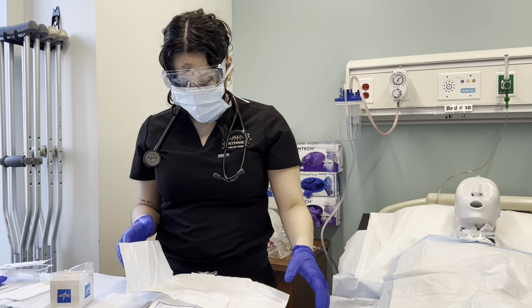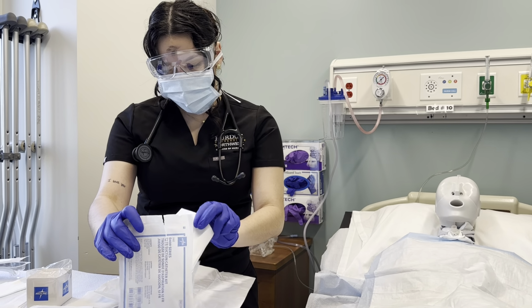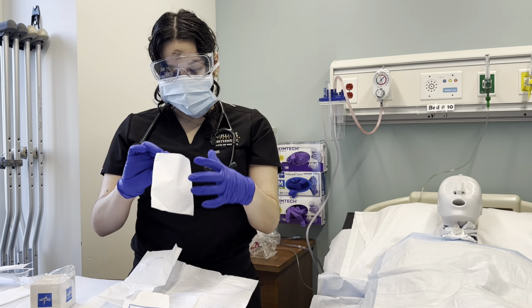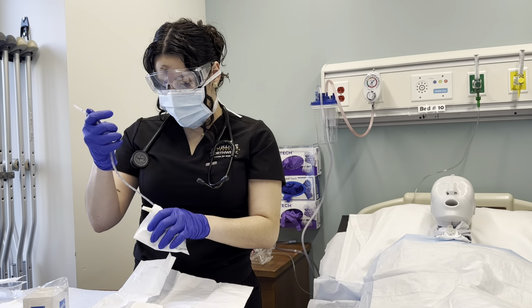Alright, once I have my sterile gloves on, I'm going to pull out the sterile catheter. With my dominant hand, I will coil it, and with my non-dominant hand, I will attach it to suction.